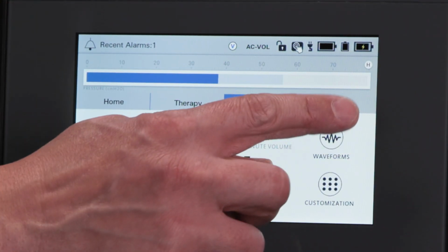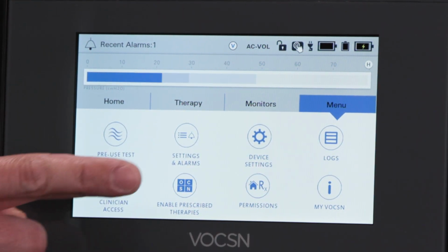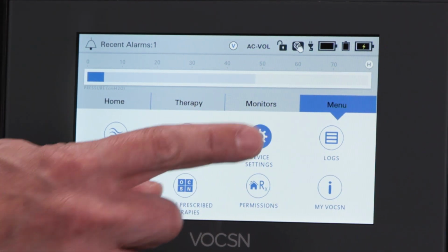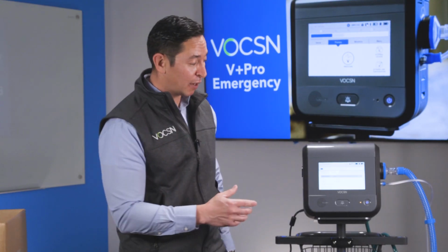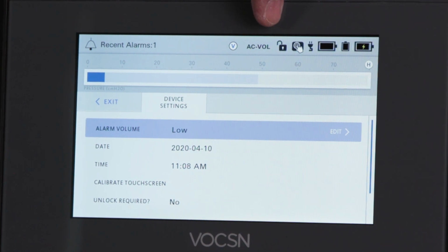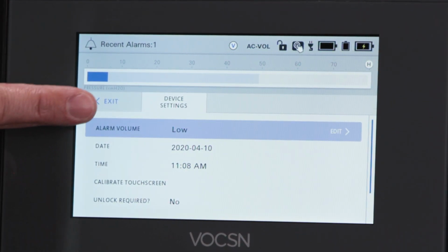And then the last tab is our menu tab. So we have the capability of doing a pre-use test. Settings and alarms, think about your ventilation settings and alarms. Device settings, so this is where you would change your alarm volume, your date, your time. If you did want to lock the clinician access, which is that padlock right up there, this is how you would lock that clinician access. I can exit back out.